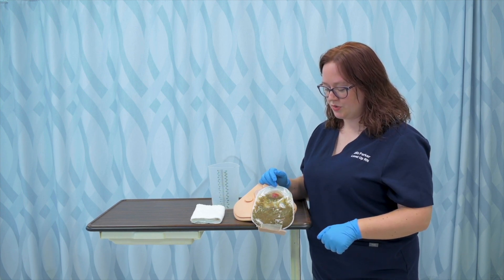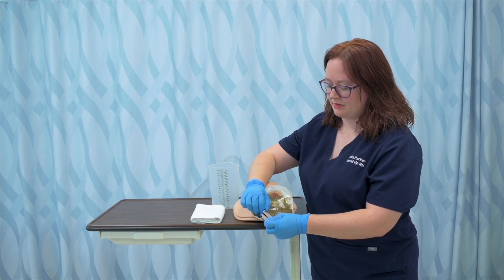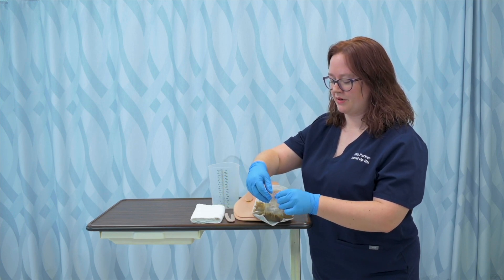To prepare to empty the bag, I'm just going to remove the clip. This particular one has a snap clip. It should be noted that there are a lot of different types of ostomy bags.